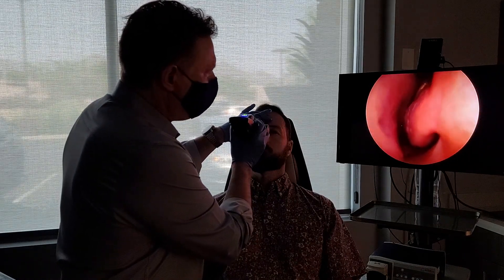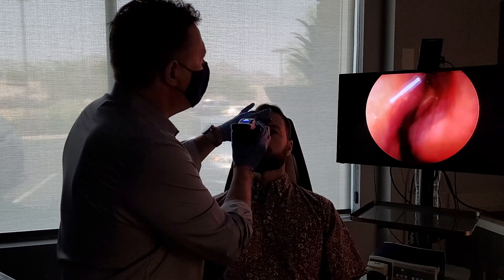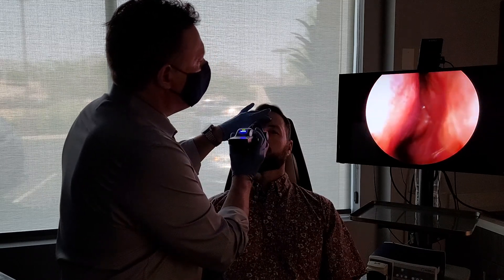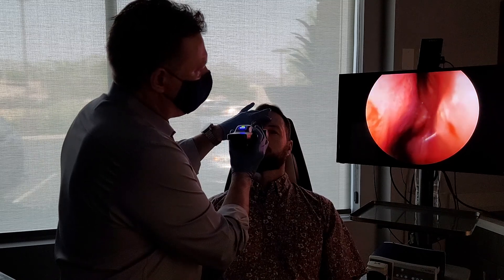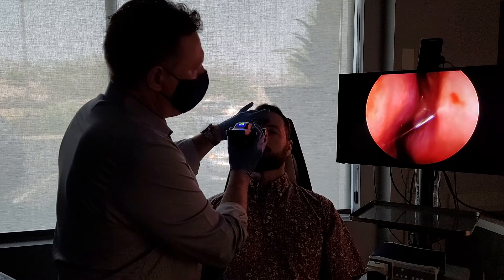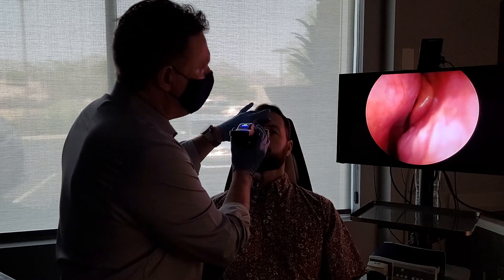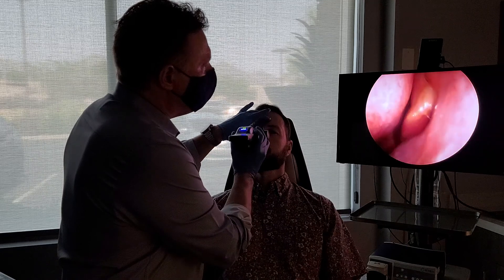Once again, inferior turbinate. Septum is on the left side. Kevin's got a little bit of a septal deviation or deflection that encroaches his breathing pathway on his left side. There's a little mucus right there in front of us — I'm gonna go underneath that mucus — and right here is the middle turbinate.